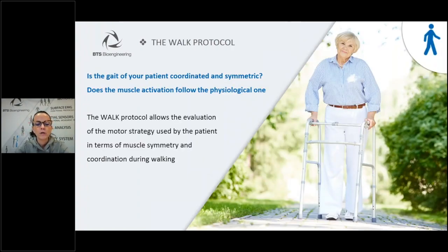Thanks to the walk protocol, it's possible to verify if the muscular activity, mainly of the muscles of the lower limbs, follows the physiological behavior, and therefore it's possible to understand if the patient has a good coordination and symmetry of the movement, or if due to neurological or orthopedic disorders, the walking is compromised and altered in some of its phases.